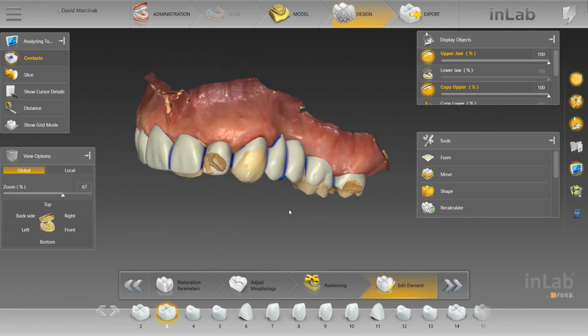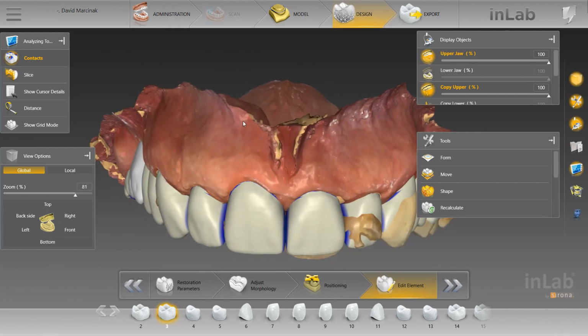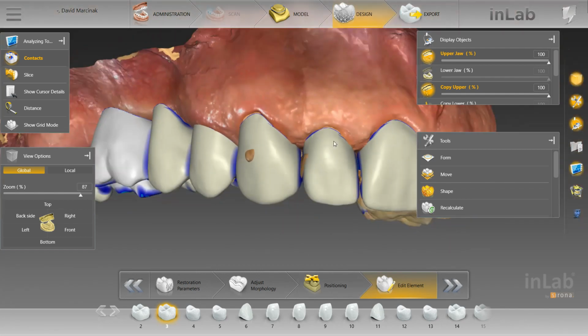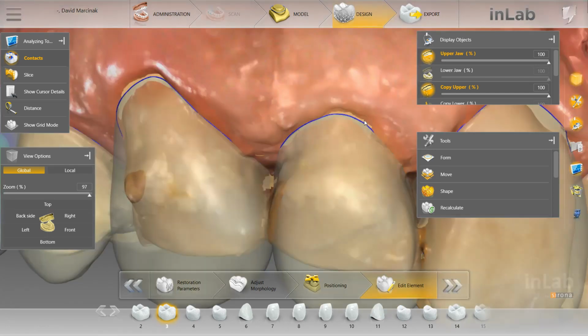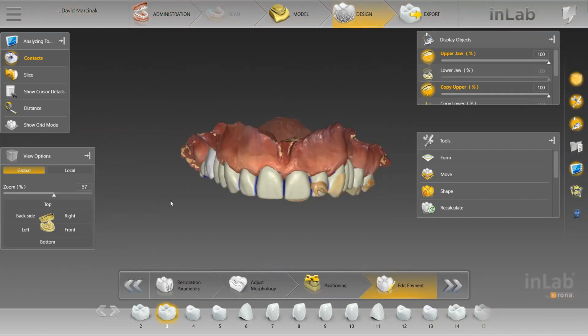Yep. So yeah, this wax up turned out really nice. And then when it comes to marking the margins, you're also going to use this biocopy scan or the pre-op scan and mark the margin where the tooth naturally emerges. That's going to also add to the predictability when you go to do a suck down or whatnot for the temps. It's going to be extremely accurate.